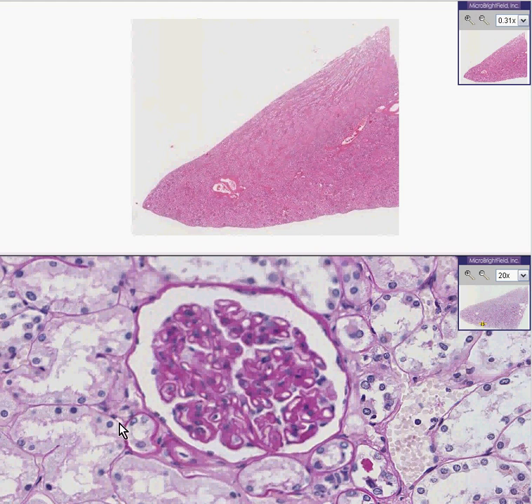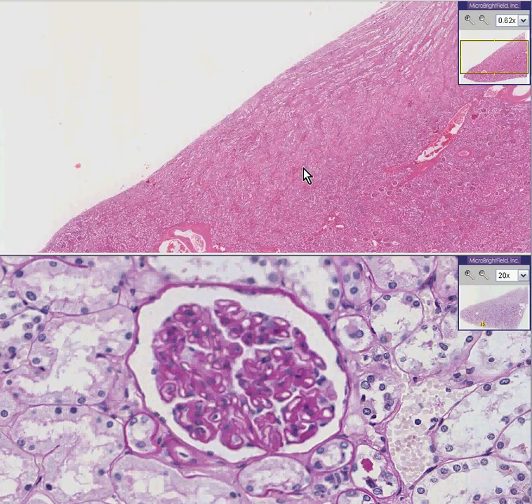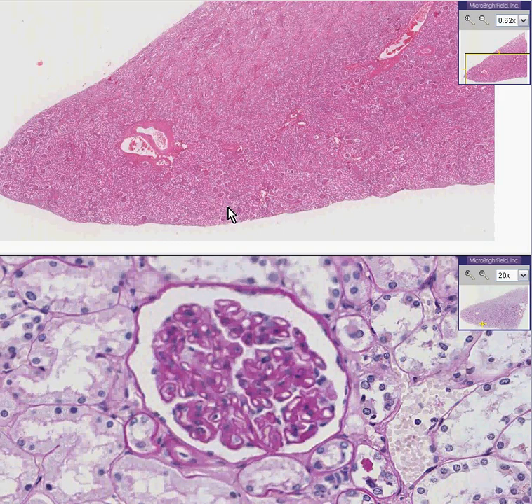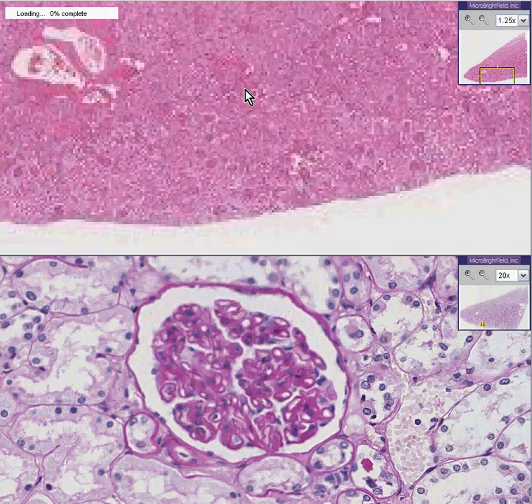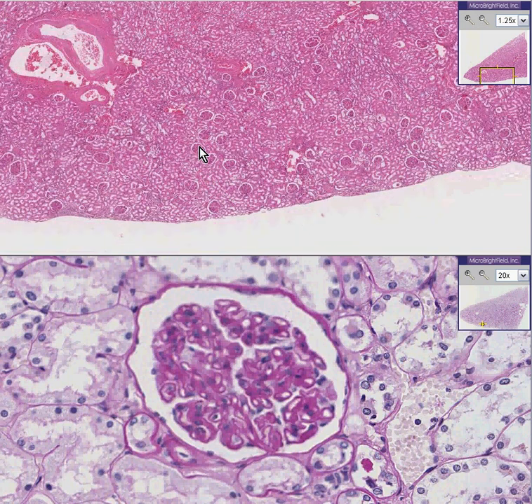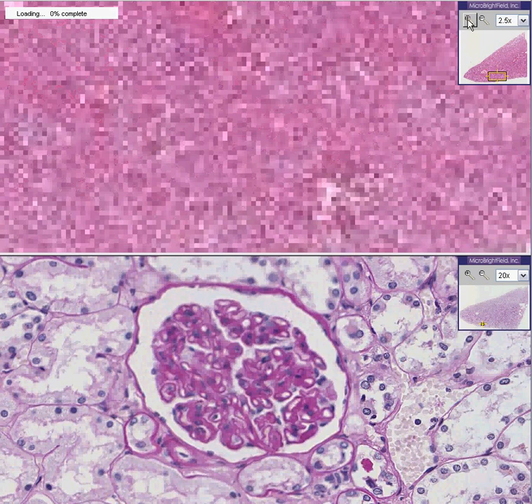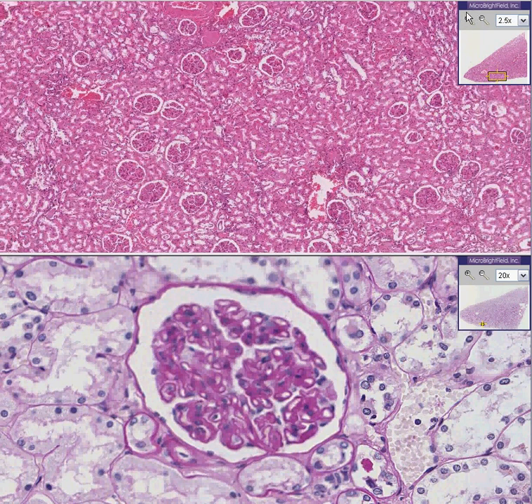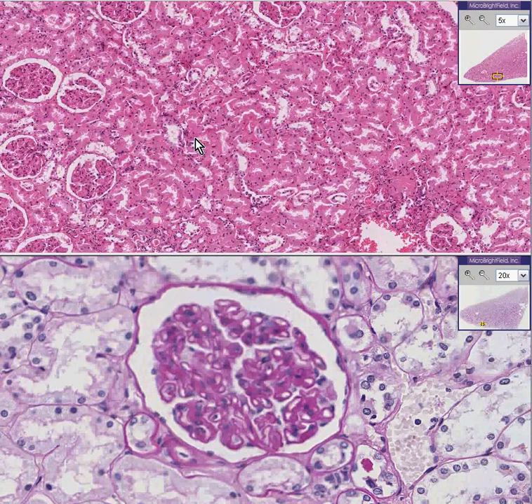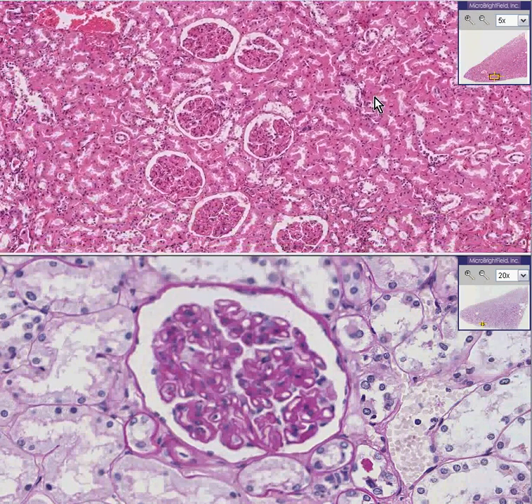This is a kidney. Here's a blow-up of a glomerulus underneath. In this case, this glomerulus — in fact the whole tissue — was stained with PAS, while the tissue on top is a regular H&E stain. You can see some small glomeruli out here, and you can see a whole bunch of tubules, and you don't see too much by way of disease within the tubules.